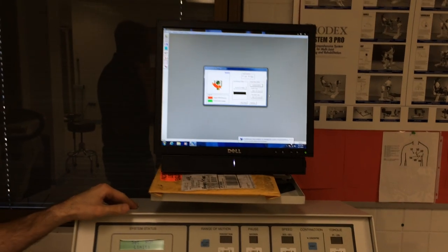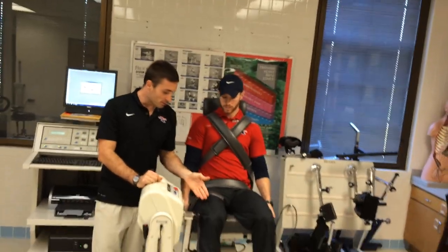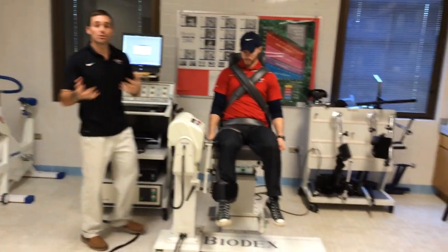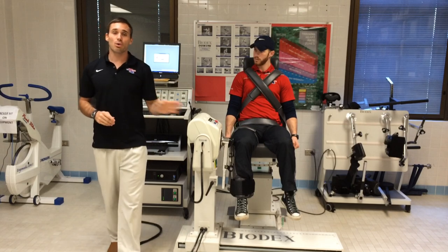What that's going to do is free Bo's leg. Now he has the ability to move his leg in and out. So you have the ability, move it out, just like that. So now he's free to move kind of freely with that range. So we need to set his away and his toward limits.